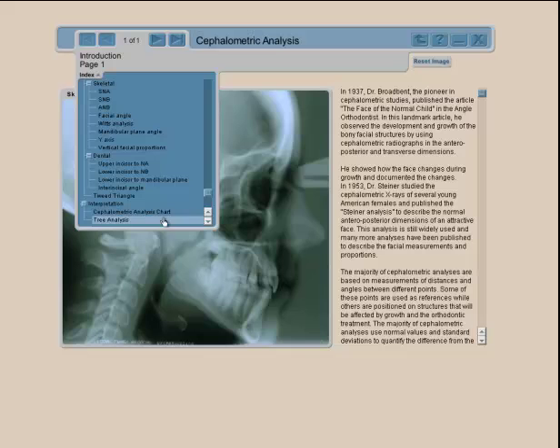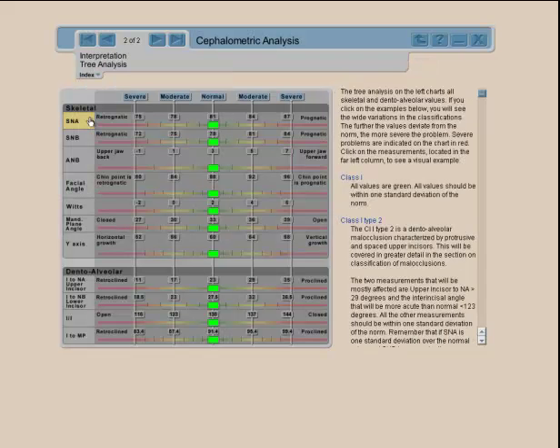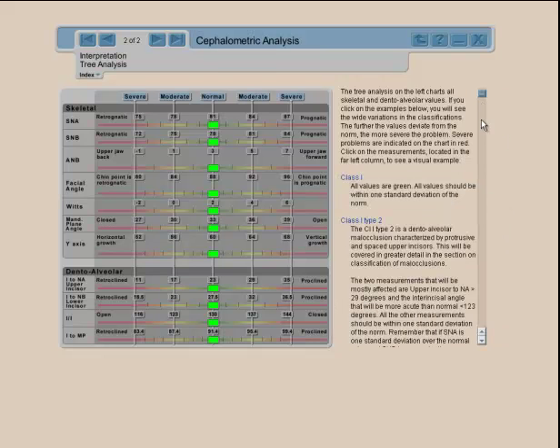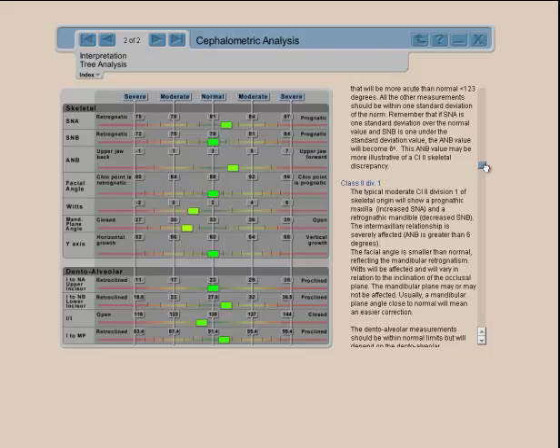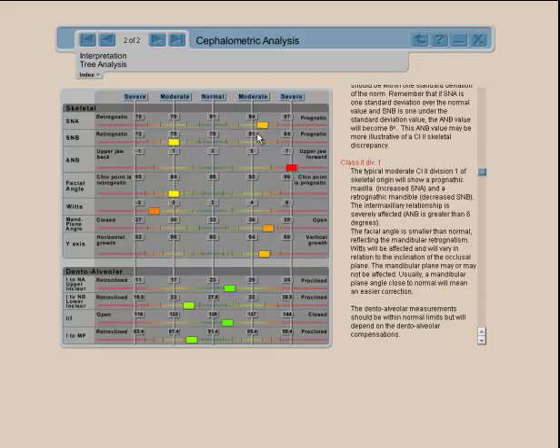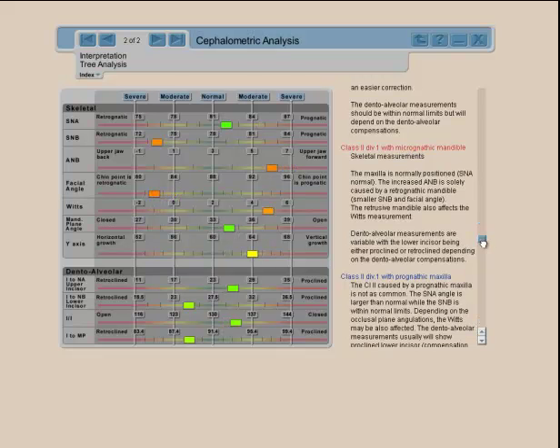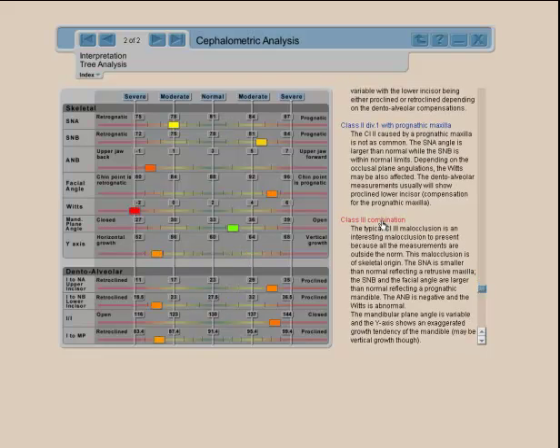This section also has an interpretation component. If you don't remember angle SNA or SNB, you can click on them. It gives you examples of what a Class I normal malocclusion looks like compared to a Class II Division 1 — which usually has a maxillary prognathic component and a retrognathic element where the ANB is larger — or a Class III malocclusion where everything is reversed, showing what the average malocclusion could look like.